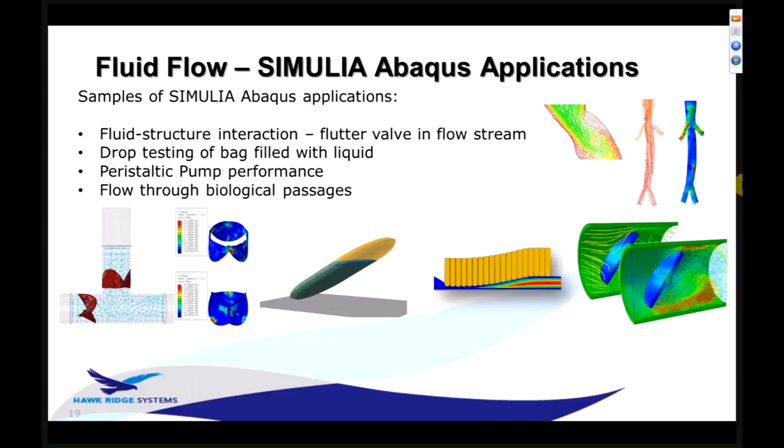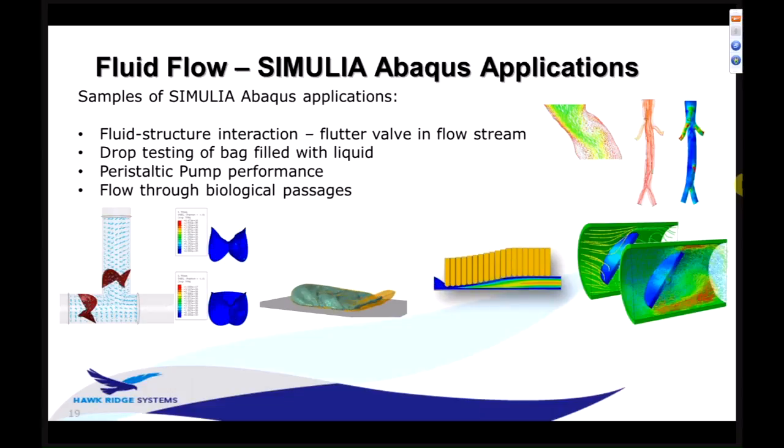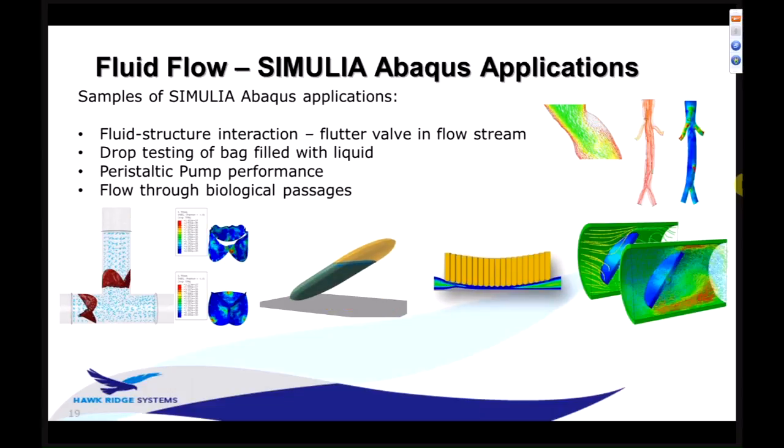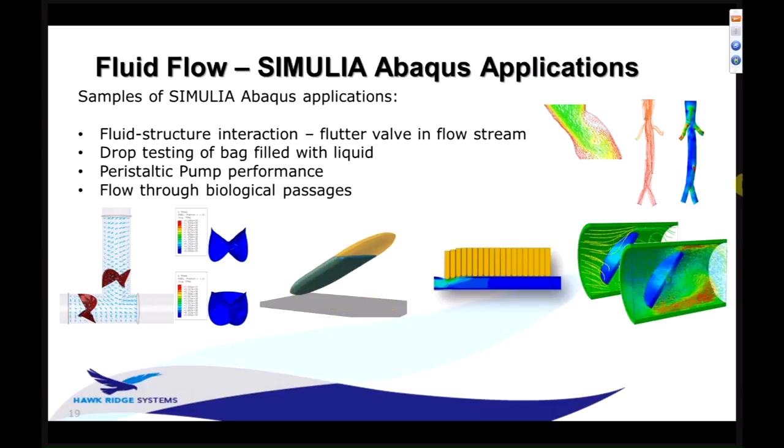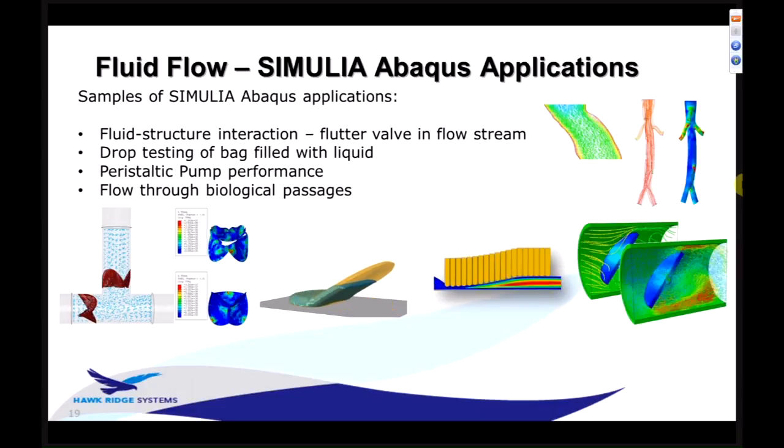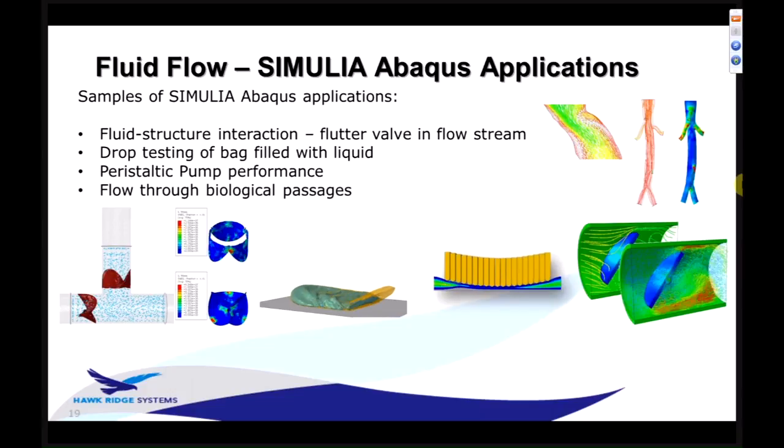We've got a few little situations here. Got some kind of flutter or deformable valves in a flow stream. And as we manipulate this flow, these objects are deforming, actually opening up. That's a one-way valve there. And so that's what we call fluid structure interaction, FSI. Pretty interesting stuff to look at. And we've got little stress contours that are being evaluated on these 2 valves in sync with what the flow is doing.